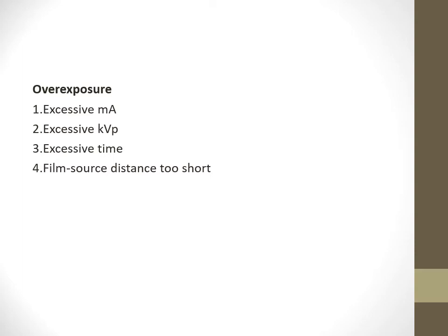Similarly, for the light radiograph, you have processing errors and technical errors. Similarly, here we have a dark radiograph, which happened due to the processing as well as the technical errors, overexposure.